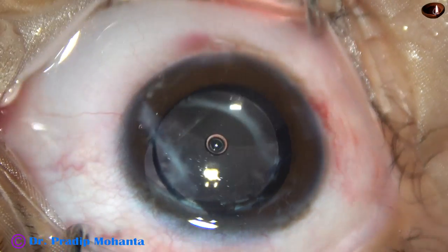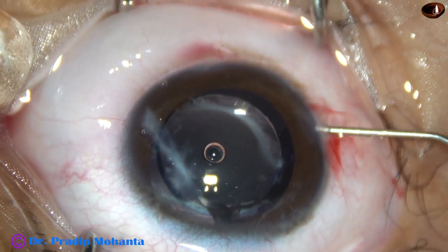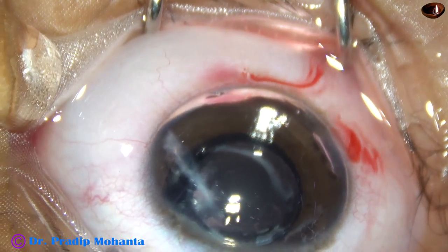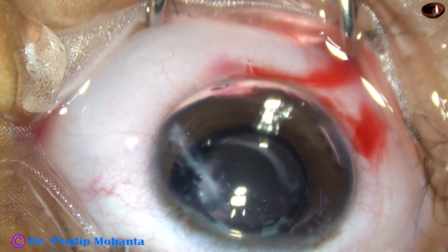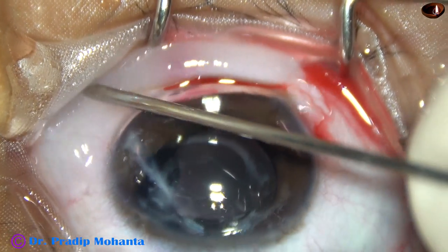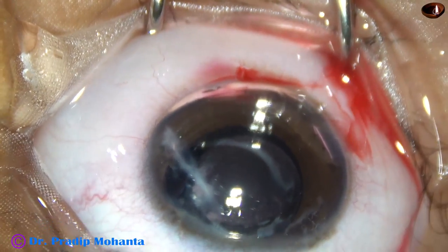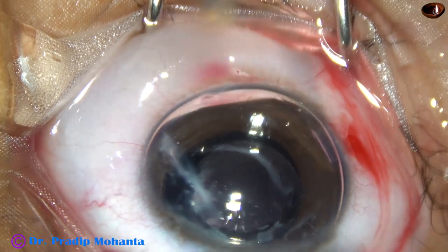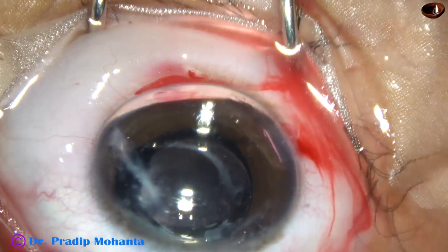Now as I remove the anterior chamber maintainer, I find that the anterior chamber has become very shallow. So to keep the anterior chamber formed, I have injected an air bubble in the anterior chamber. And now there is some chemosis — making some punctures in the conjunctiva so that this fluid gets drained easily and very fast.